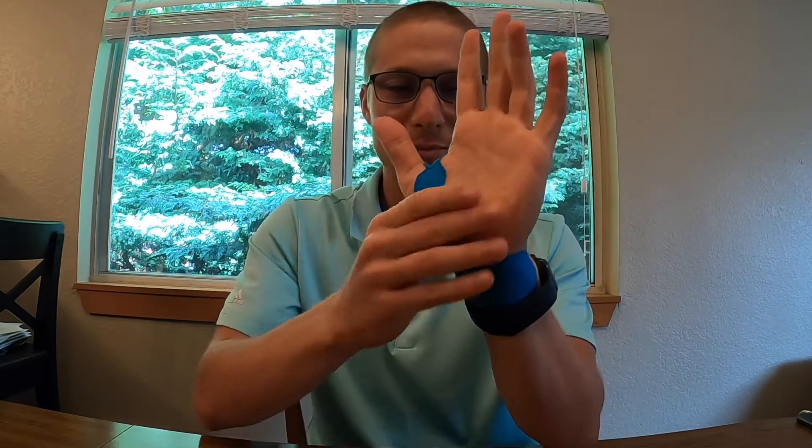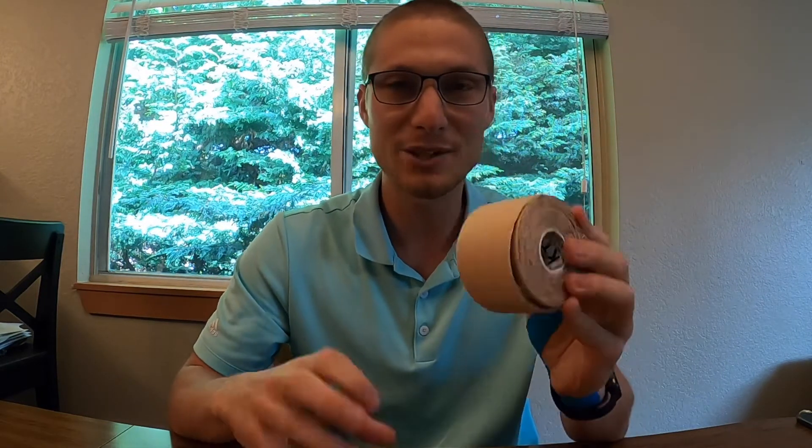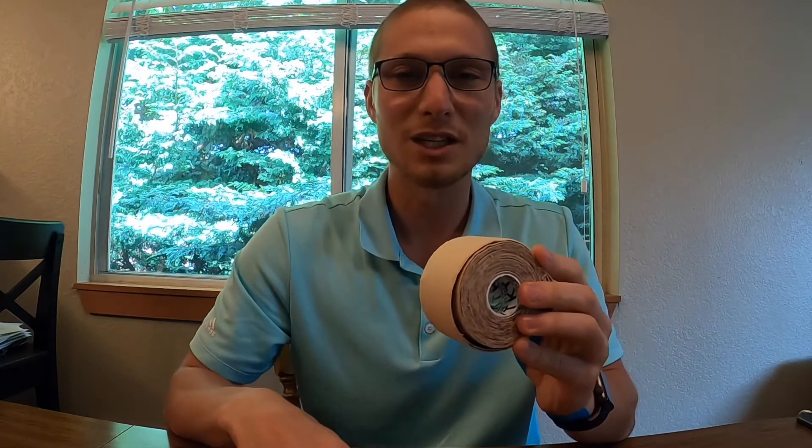Hey everybody, it's Dr. Hankins. Today I wanted to show you one of my favorite ways that I deal with wrist pain. Sometimes excessive use of extension of the wrist like this can lead to pain right through here or right into the thumb. In order to address that, we use kinesio tape.